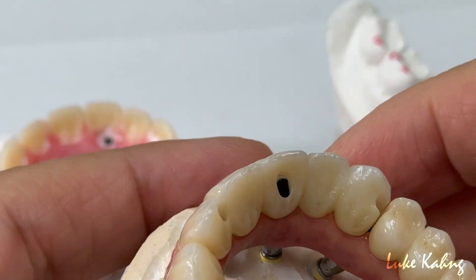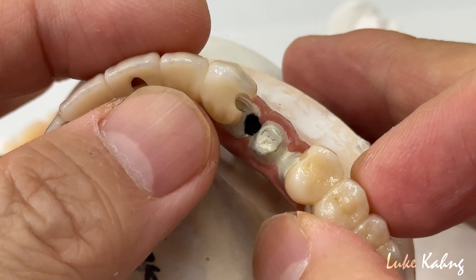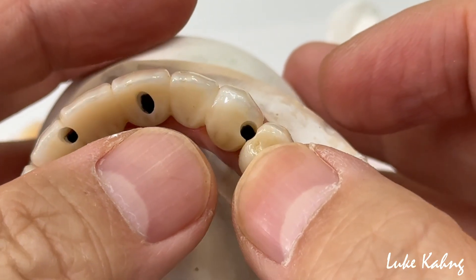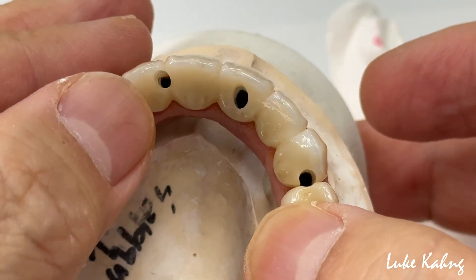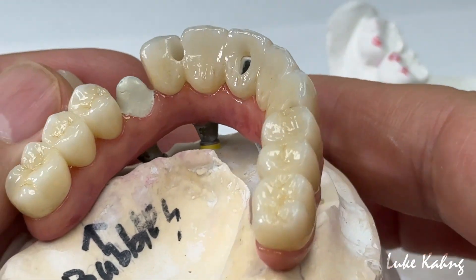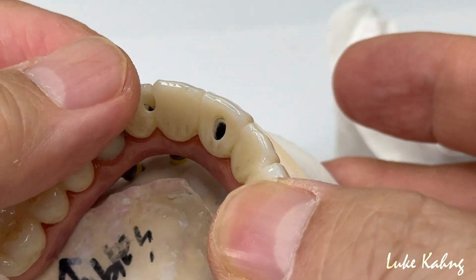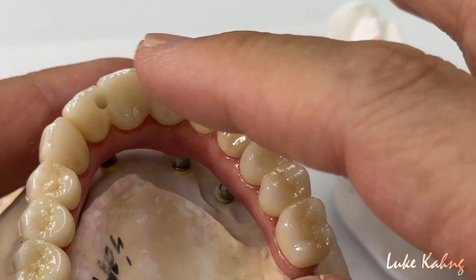So now it's almost done. Before we cemented these cases — remember I mentioned between the implant side — it's perfectly matching right here and there. So that's actually going to go down. And also here, there's one implant which is really far out facially. The doctor is going to be using this temporary cement. So technically we're using only three implants — one, two, three.